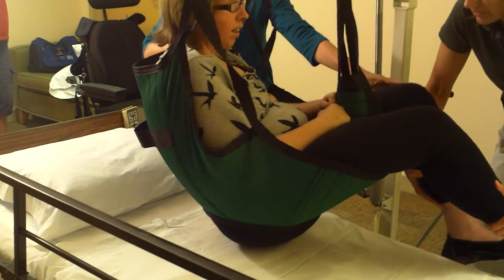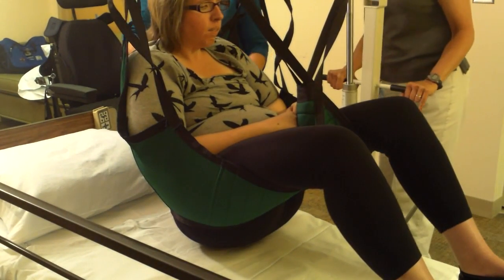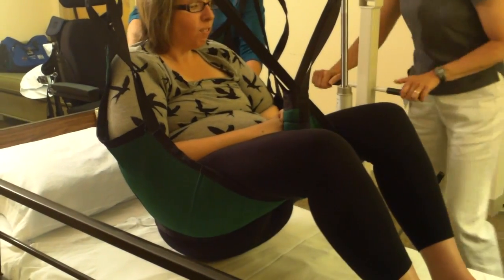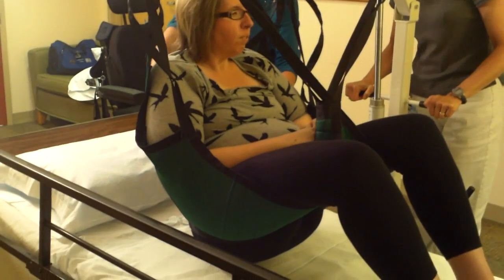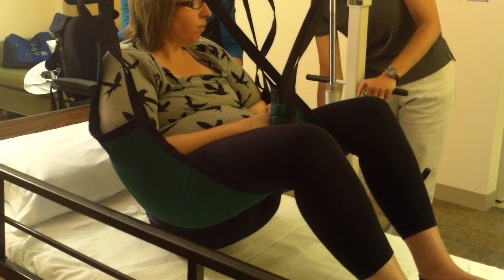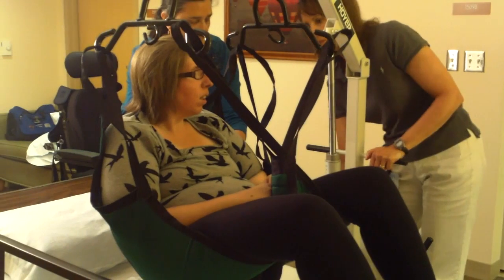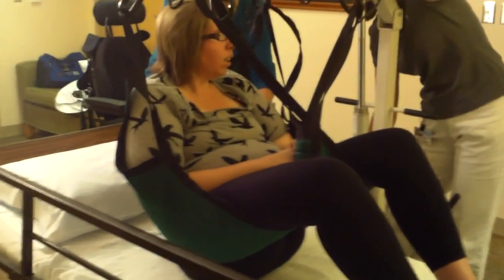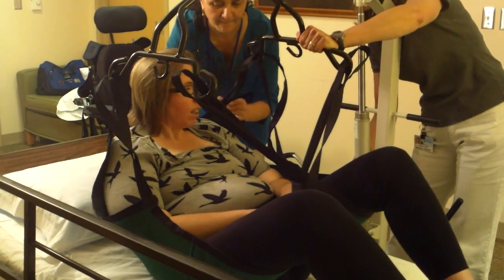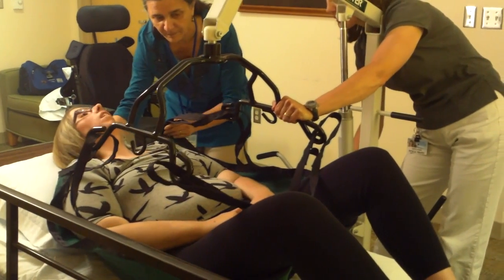Once you have the patient positioned, you want to make sure that you turn them around so as to position them as they would in bed. We'll lock the Hoyer lift in position and very slowly move the knob counterclockwise to lower the patient in bed.